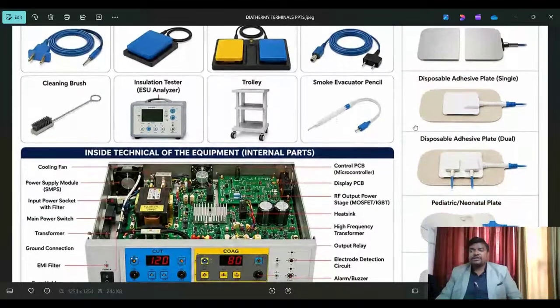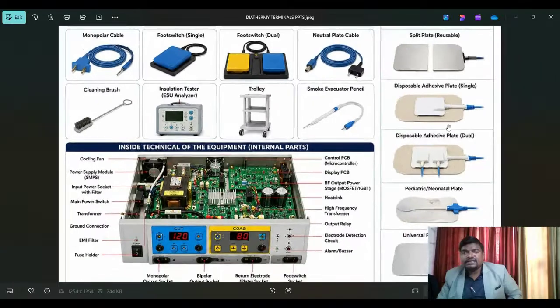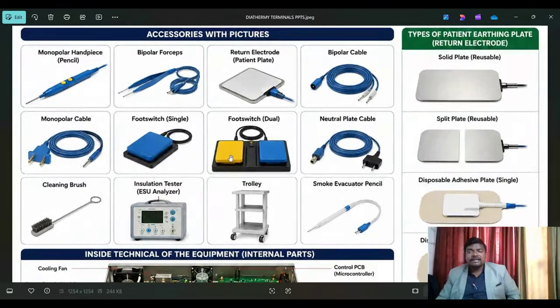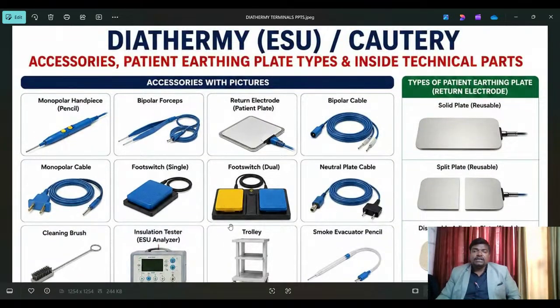Biomedical engineers, see here, these are the main basic spares and accessories, and on a daily basis they get damaged, depending on operations and usage. So every day, or otherwise weekly, we have to coordinate with the operation technician, and then with the head of that department. Departments like neurosurgery, cardiology, and so on, for every organ in our body there is a department in the hospital.